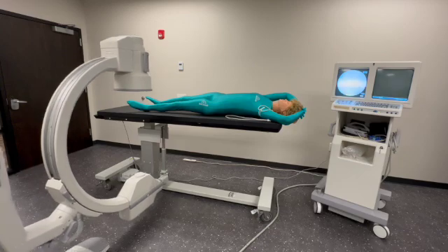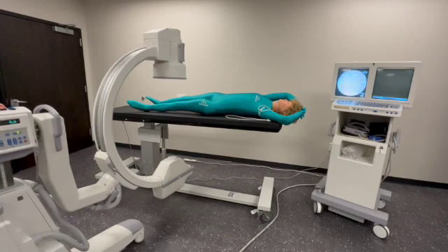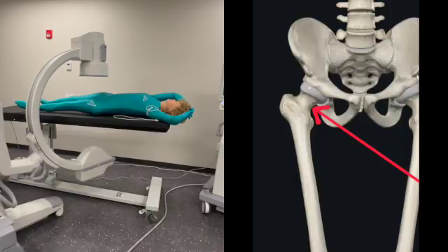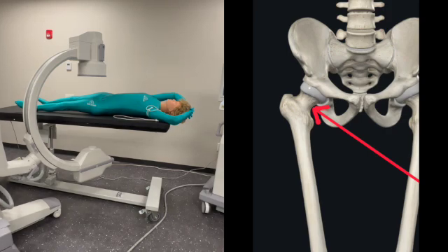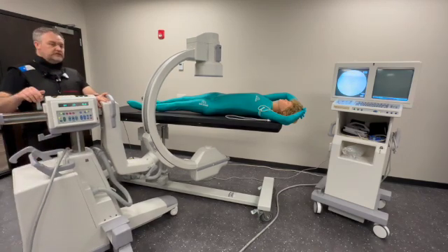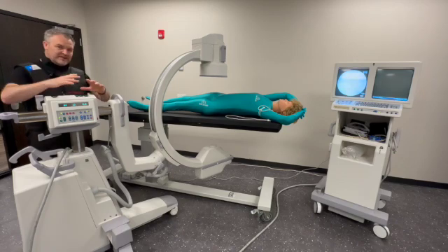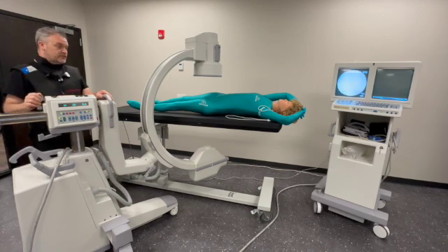When we approach the table, what we have to remember is we are interested in imaging the surgical neck. I'm going to come in at an angle that is perpendicular to that surgical neck. When I come in, I don't want to come in all the way with my boom arm closed. I want to set up so that for my AP I would just have to extend out a little bit, and that way it gives me a chance to close my distance when I come in for the lateral. So let's go ahead and look for our lateral first.